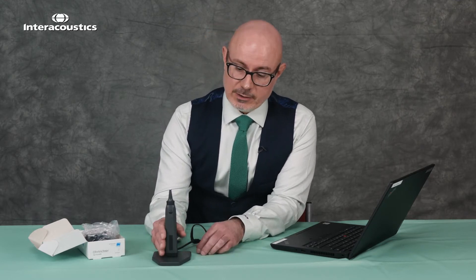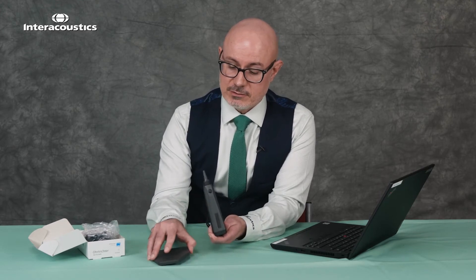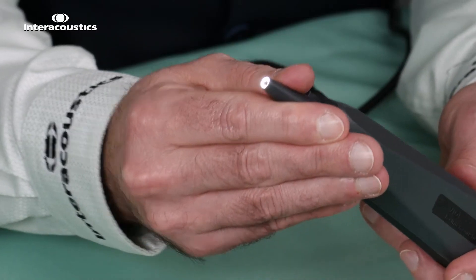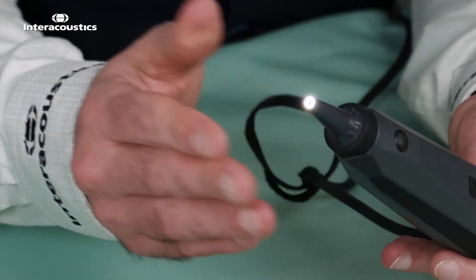Once we take the hardware out of the box we've got some main components that we can take a look at. We have the base unit which is rather heavy but is also magnetic, and that keeps the viat secure when not in use. You'll notice it comes supplied with a tip already in situ — that's just for safety. We'd recommend leaving a tip on the viat when not in use to protect the end.